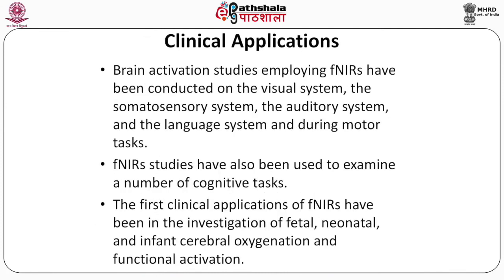Now, after discussing the apparatus setting, the principles and various system types, next we come to the clinical applications of this technique, that is functional near infrared spectroscopy.